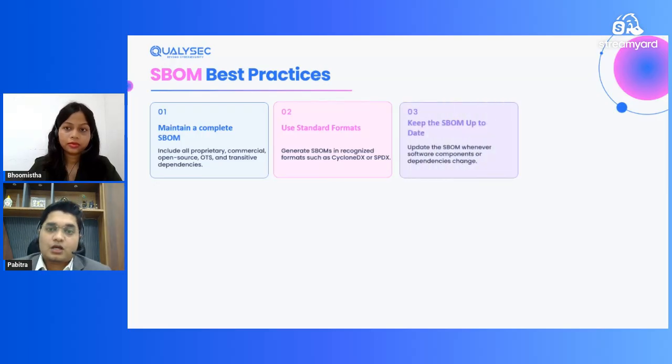Then keep the SBOM up to date. Never share a report which is 1 year old, even 6 months old, even 4 months old. I'll tell you, give the latest report to the FDA. It will give them the visibility that you are not just secure, you have a secure attitude and secure mindset. So give the latest report.